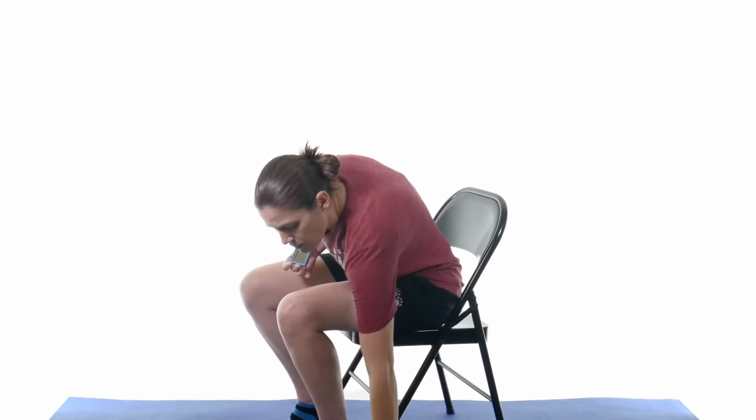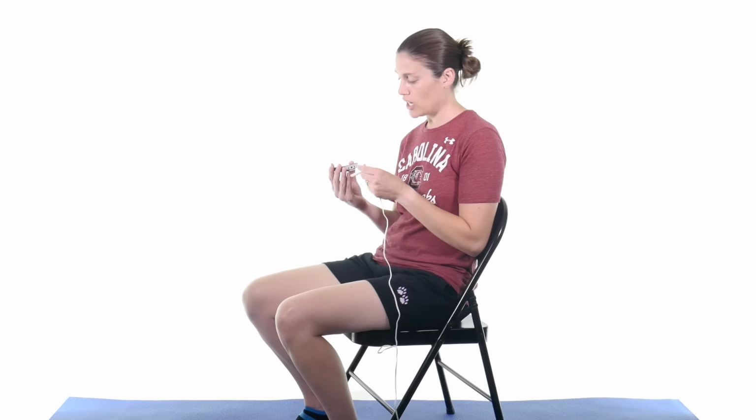So I'm going to start off with using 4 electrodes. With a TENS unit, you can use either 2 electrodes, which is one channel, or 4 electrodes, which is 2 channels. And so you can connect them here. What makes it nice is each channel has 2 electrodes. So if you're just trying to get general hip pain, usually using 4 electrodes is the best, because what you want to do is make each channel cross.